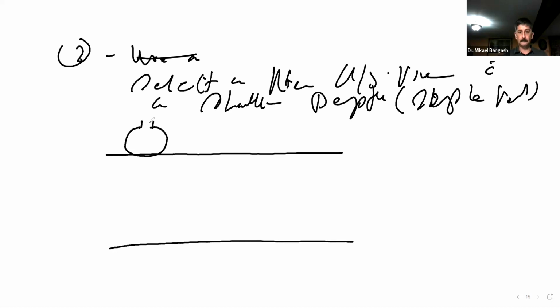Now the reason that we use the word sample volume is because we are still talking about a pulsed wave, using a pulse wave transducer in a pulse wave Doppler mode. Because it's only going to be in this that we have aliasing.